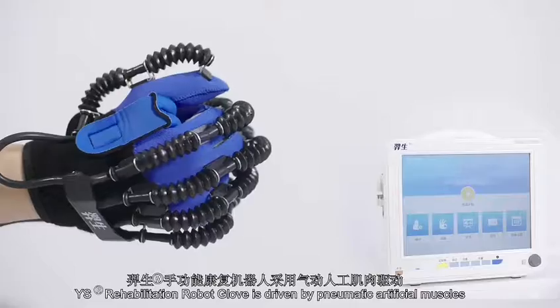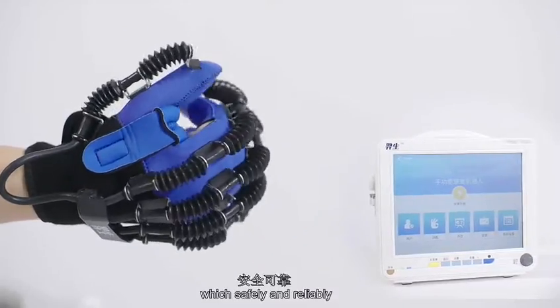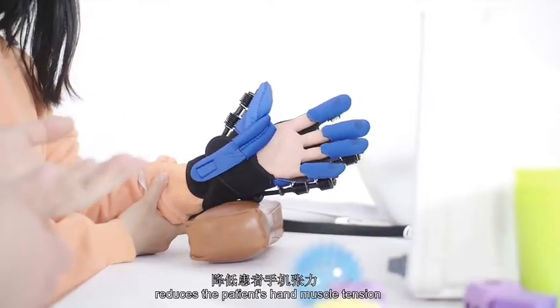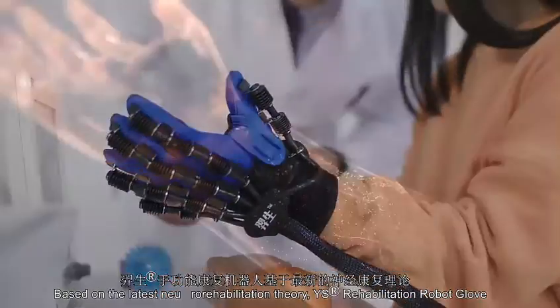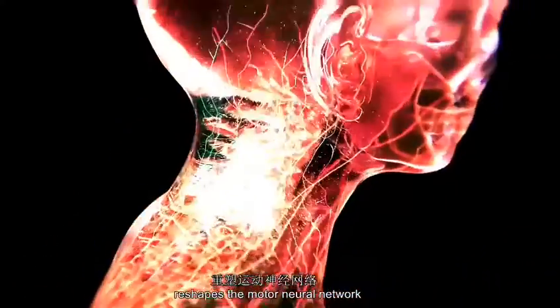YS Rehabilitation Robot Glove is driven by pneumatic artificial muscles, which is safe and reliable. It assists the finger's passive flexion and extension, reduces the patient's hand muscle tension, relieves joint edema and stiffness. Based on the latest Neuro Rehabilitation Theory, YS Rehabilitation Robot Glove reshapes the motor neural network.